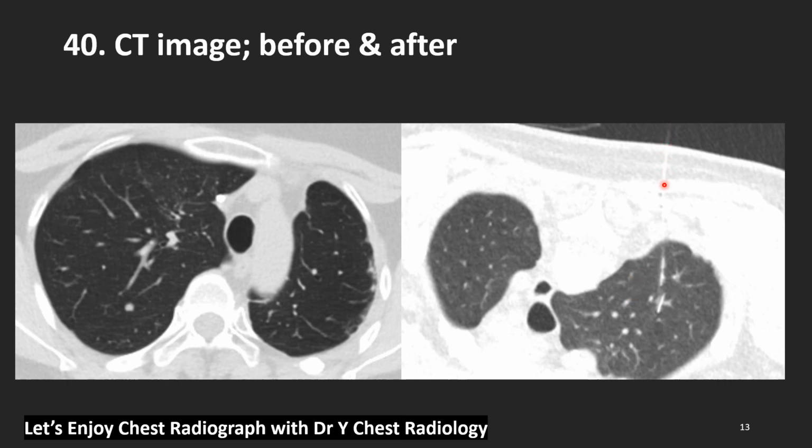I introduced the hook wire needle here. Yes, it is not exactly to the target nodule, just around the target nodule. So I can tell the surgeon where the nodule is in relationship with the needle tip. And the surgeon took out the nodule after surgery.